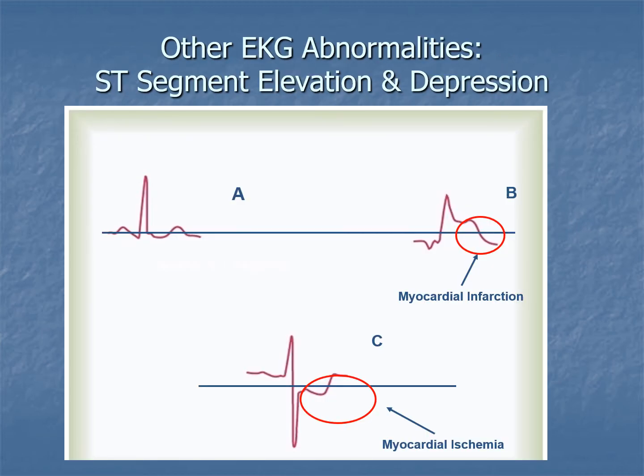Many of you have heard the term, you've encountered it in a clinical setting, you might have encountered it in your personal life with a loved one or a friend, a STEMI. So STEMI is an ST elevation MI. What you're looking at there, in the upper line, what's labeled B, is a myocardial infarction, and one where the ST segment is elevated. It's one of the hallmark signs. So STEMI means ST elevation myocardial infarction.